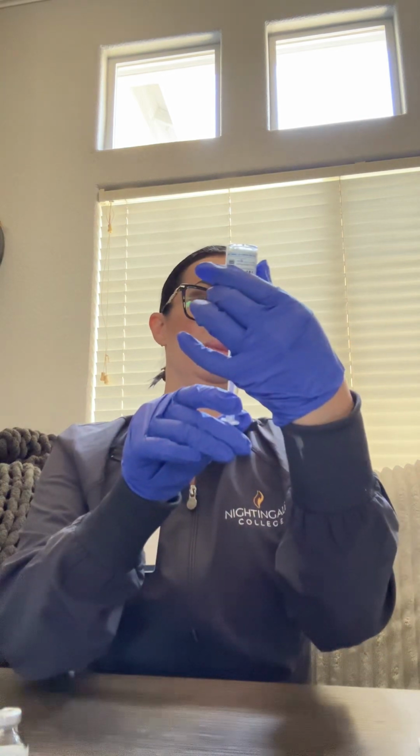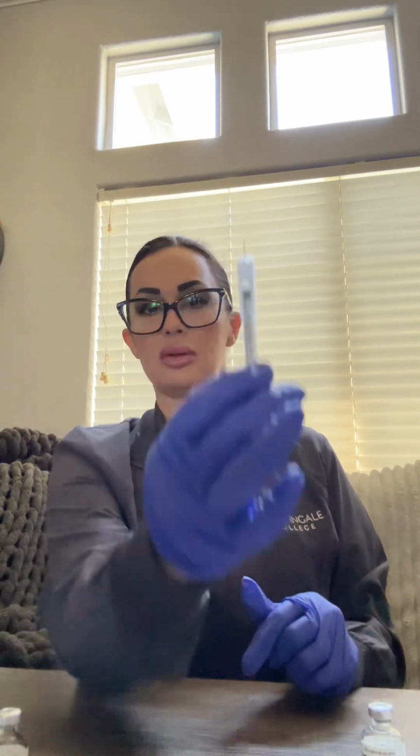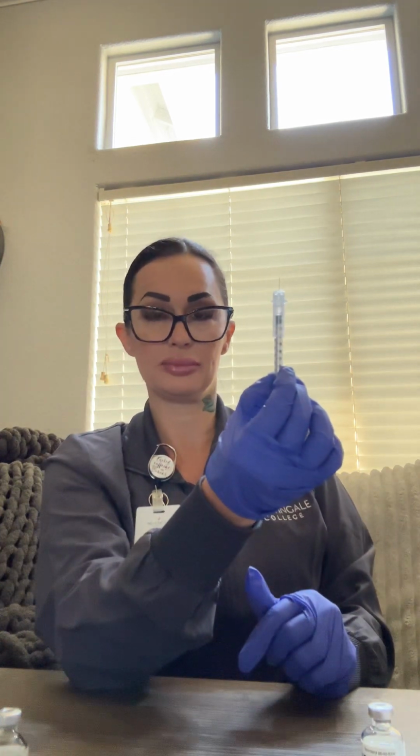And at this time, you're going to withdraw the remaining 8 units of medication, making sure that you do not overdraw, which is the desired amount. If you can see the amount here. All right, so you just want to recheck that you have your 12 units, which we do here.